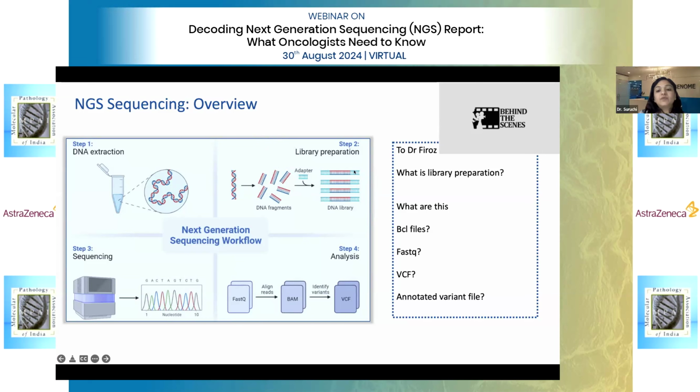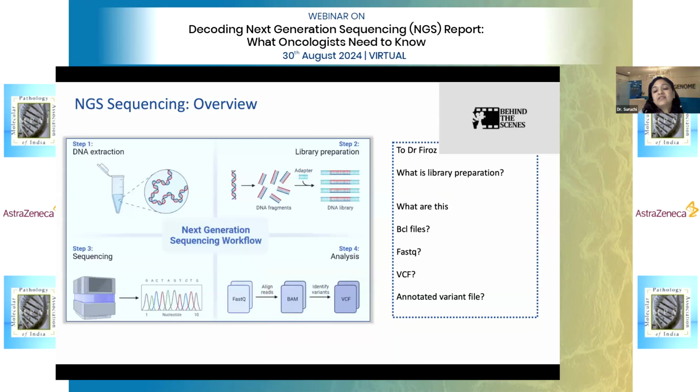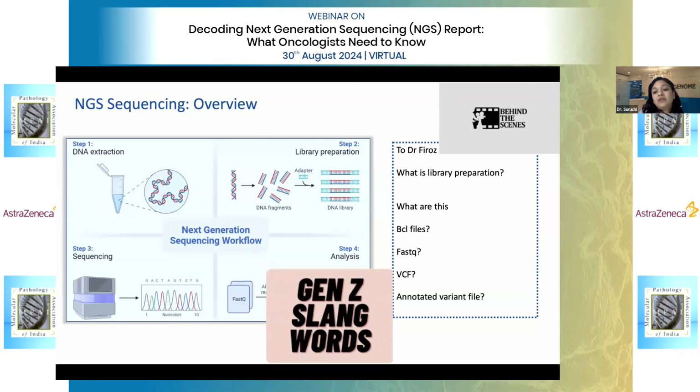Dr. Suruchi, if you have a different answer to this? Yeah, I would like to add. So basically, the variant call file has the variants that we have observed in the test sample as compared to the reference genome. Now we have to annotate it. Annotation happens based on available literature evidence and variant minor allele frequencies in population databases and so on. There are different parameters to annotate these variants. After these variants are annotated, the genome analyst will interpret them.